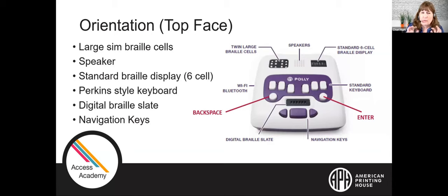We're going to do a very brief orientation for you on the Polly. On the very top face of the Polly, the top left corner has two twin Braille cells. The center is where the speaker is located, and on the right-hand side there is a standard six-cell refreshable Braille display. The Polly has a refreshable Braille display for our earliest learners — so exciting.